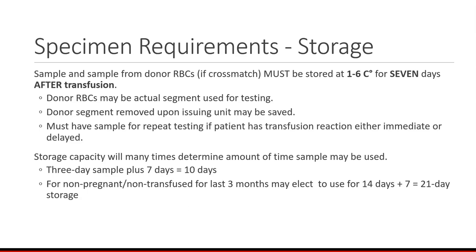Storage capacity will many times determine the amount of time a sample may be used. For example, a 3-day sample plus 7 days equals 10 days. So that's what we do for all patients. Their sample is good for 3 days. We have to keep it for 7 days after transfusion. So by keeping it for a total of 10 days, we'll meet both of those requirements.